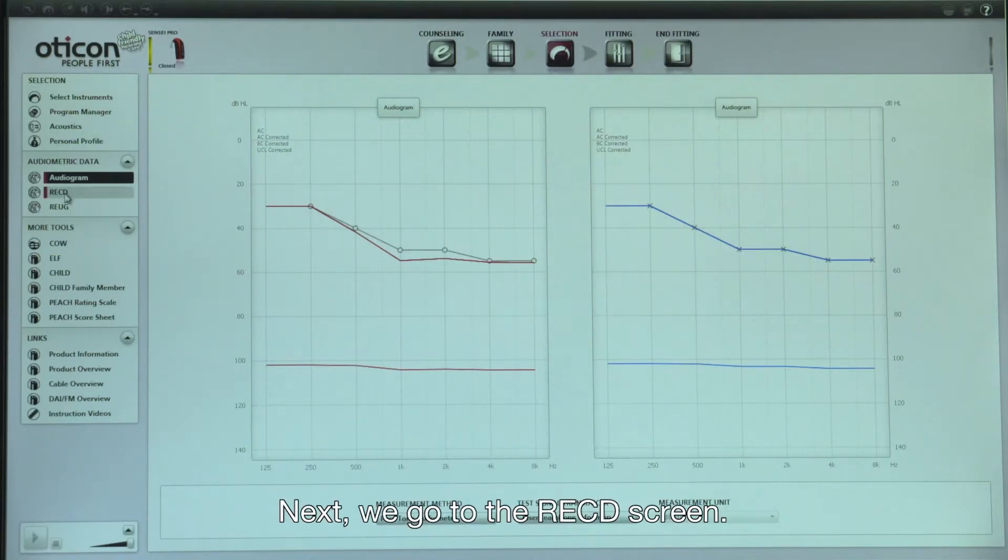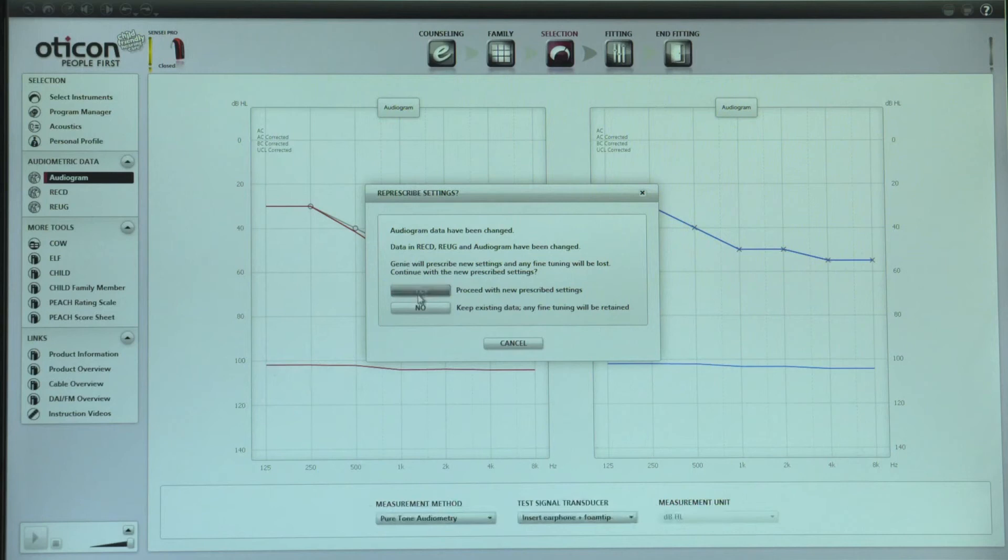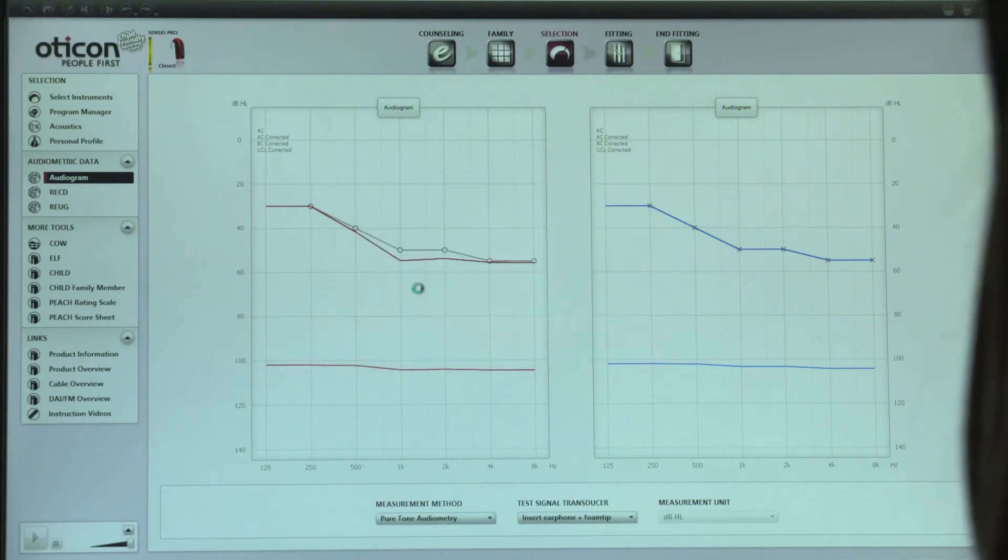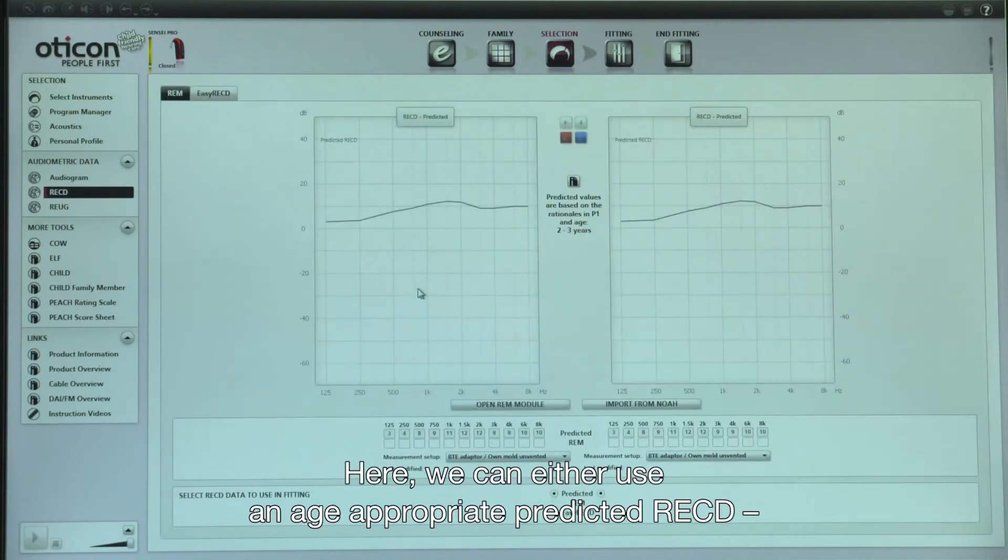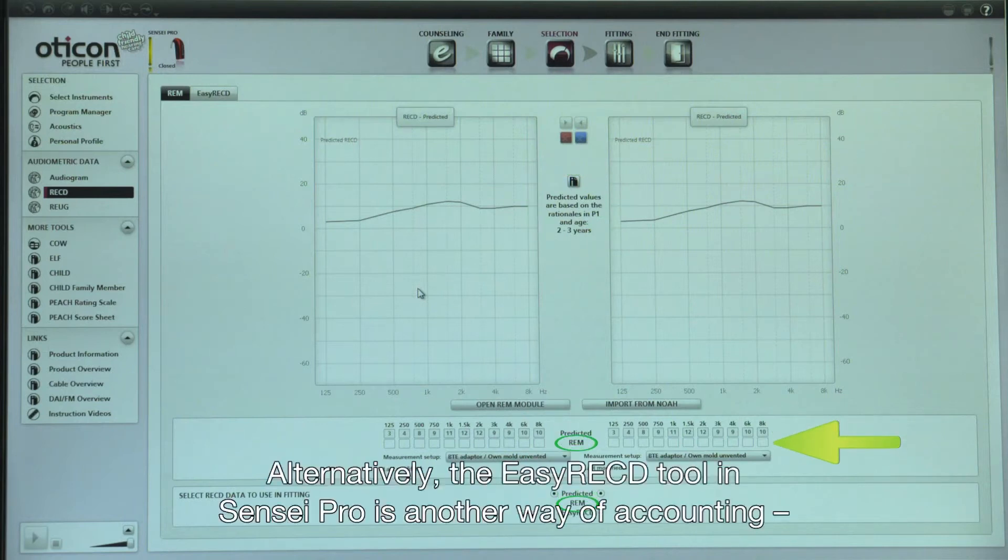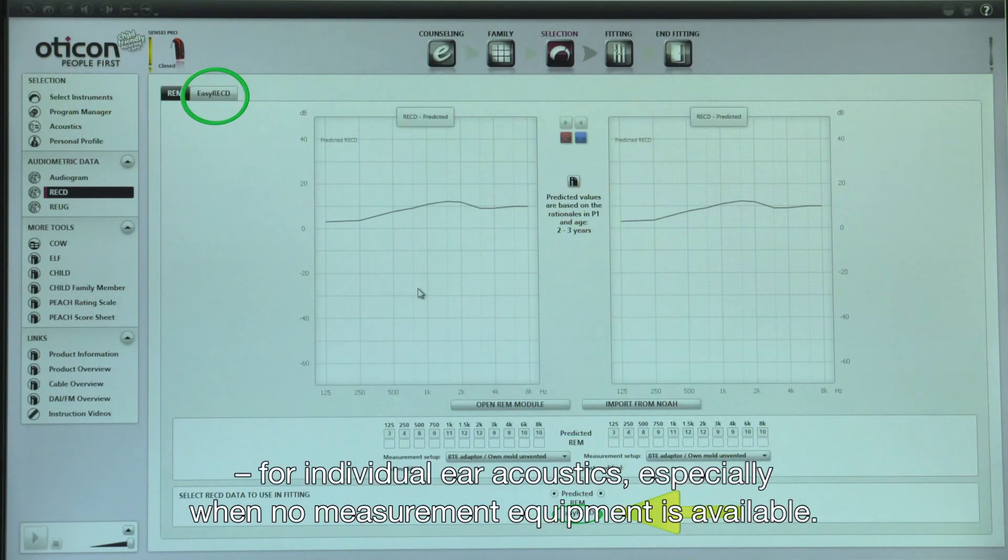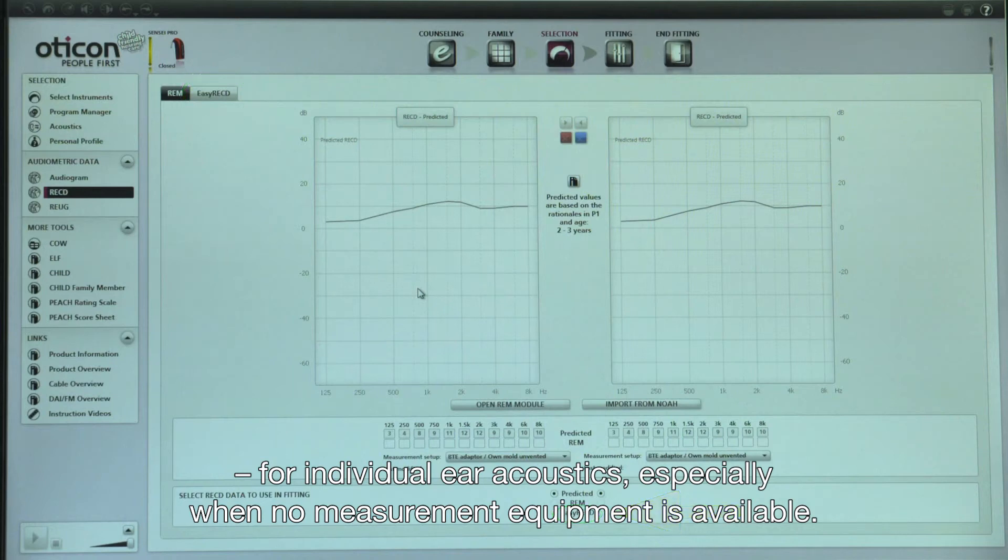Next, we go to the RECD screen. Here, we can either use an age-appropriate predicted RECD or enter a previously measured RECD. Alternatively, the easy RECD tool in Sensei Pro is another way of accounting for individual ear acoustics, especially when no measuring equipment is available.